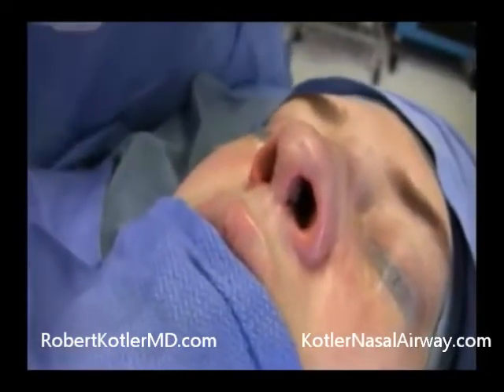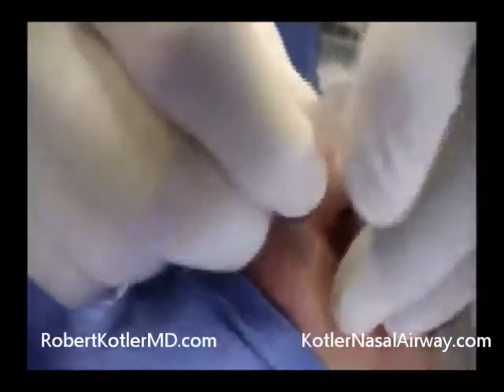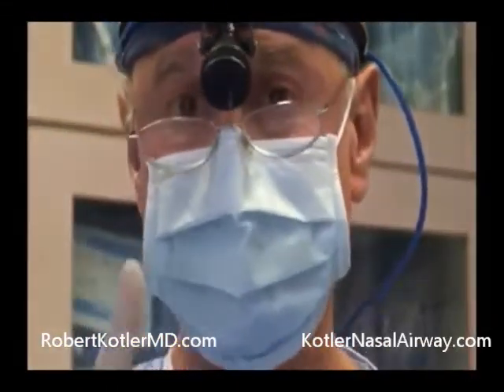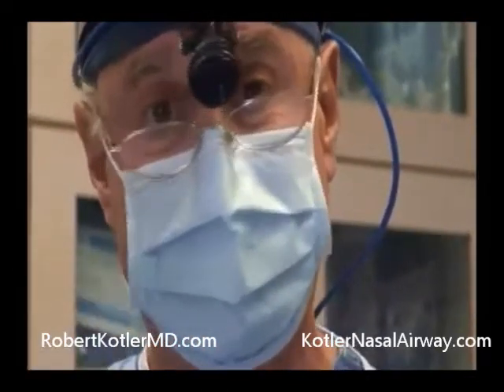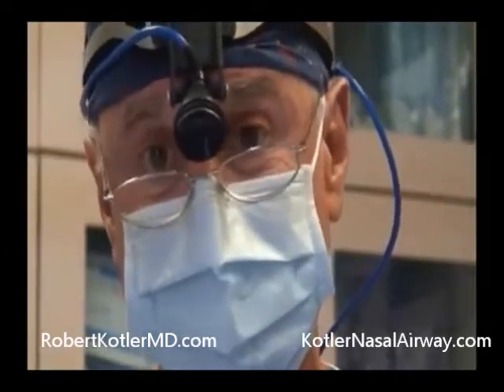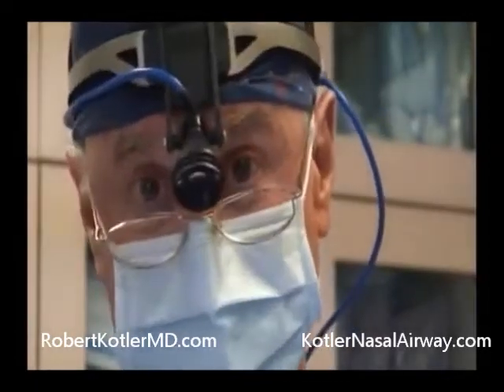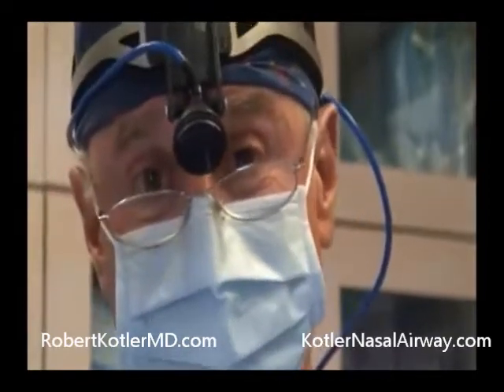Good. Now we're going to insert the nasal airway. We pass both tubes into the nose, passes down into the interior, and then we want to check the position. This is very important. The tubes must rest on the floor of the nose. There's 2 reasons. First of all, it's a silent area, hasn't been operated on. There's no chance of damaging any of the tissue that may have been operated on. And secondly, that assures a straight course back into the nasopharynx without any buckling of the airway. And it also provides the proper room for any packing.